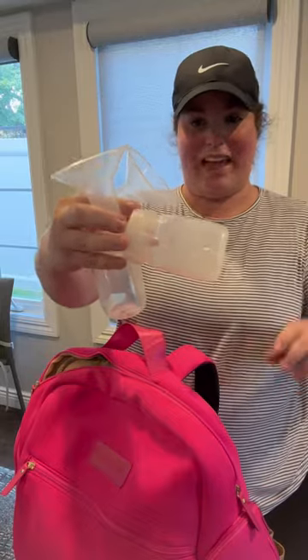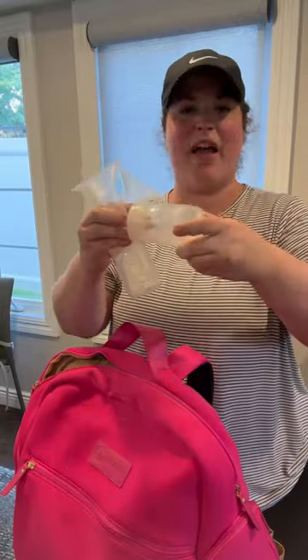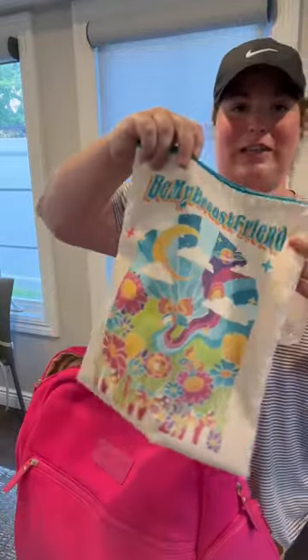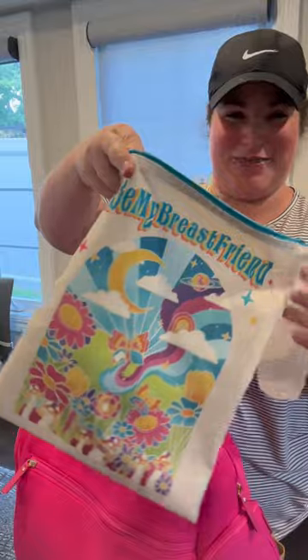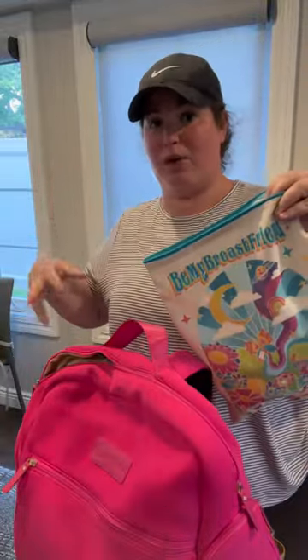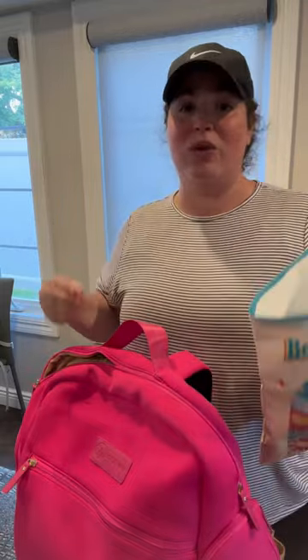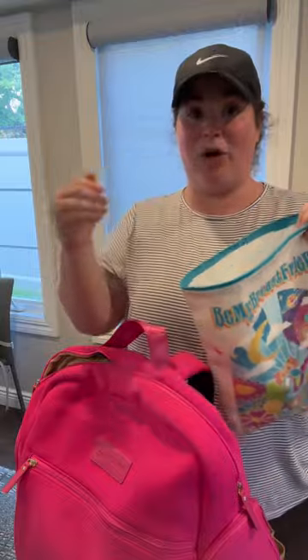Next, we have pump parts — flanges attached to bottles. Make sure your duck bills are already there. I like everything fully assembled. I put this in my wonderful Lisa Frank bag and keep it in here. I'll also use this once my pump parts are dirty — I'll stick them in here as well. If I am planning to reuse these parts again, I will also stick an ice pack in it.